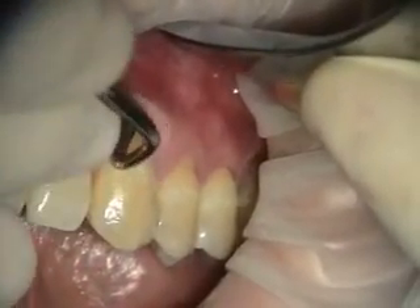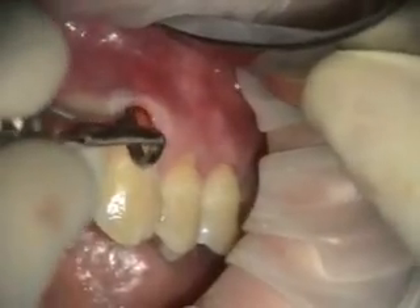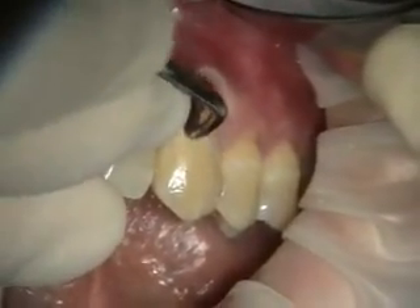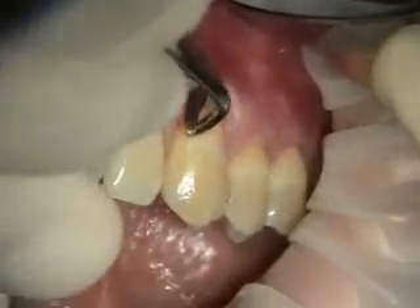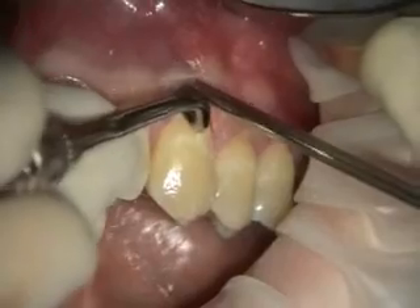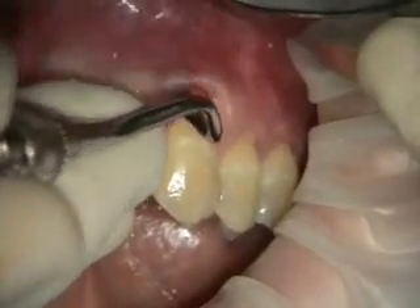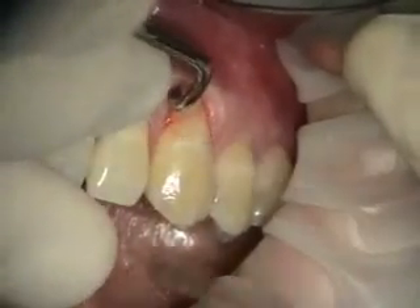This is a modified orban knife, modified by Pat Allen. I watched his video and I love this thing. I tell you, dentists in general and periodontists as well — there is no loss for people who are innovative, people that embrace change.